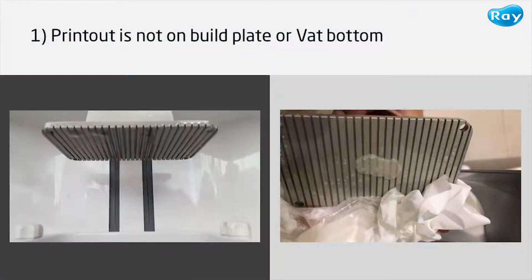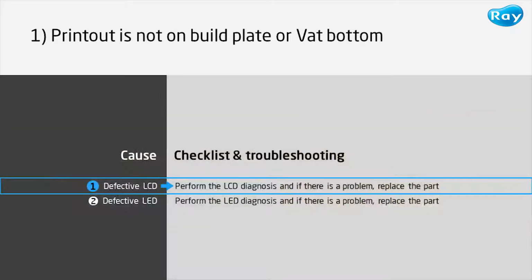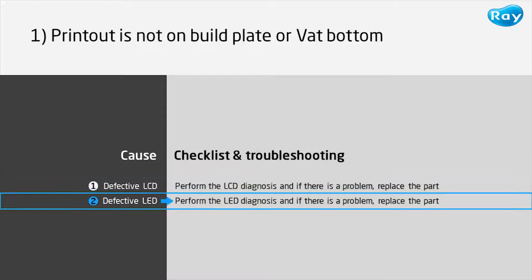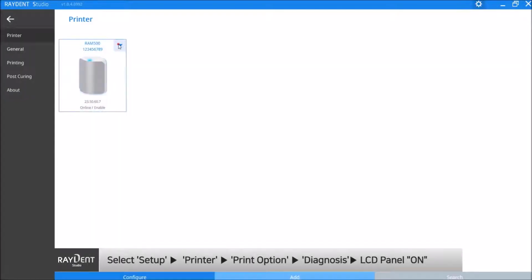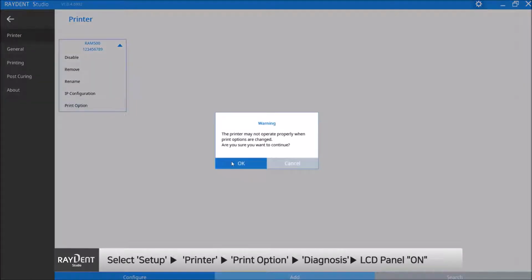Number 1. If the printout is not on the build plate or VAT, you should check the LCD or LED, which is the light sources. And let me walk you through the process. Click the setup icon on the top right corner and click the printer. Then an arrow will appear. Click the arrow to open the menu. Click the print option at the bottom and click OK when the setting change warning pops up.